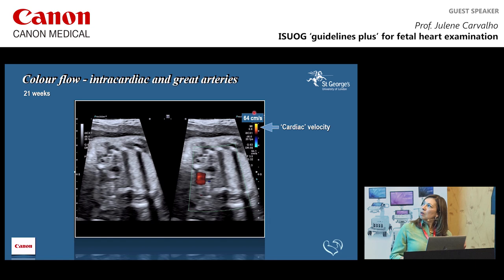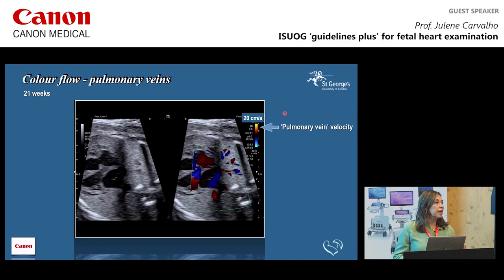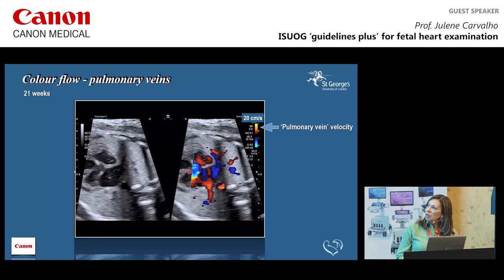For pulmonary veins, as seen here in a dual display with the left atrium, pulmonary veins come from the left and right lungs in different colors. The velocity is much lower — about 20 centimeters per second in mid-gestation. The intracardiac velocity shows aliasing at this low setting, but there is a nice display of pulmonary veins — the left lung in red and the right lung in blue.